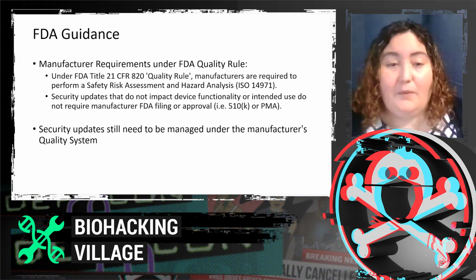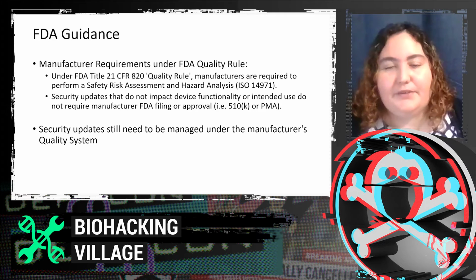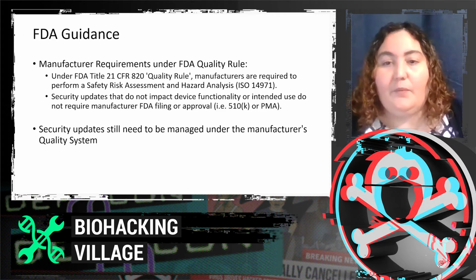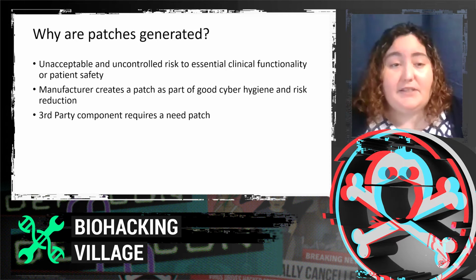Security updates are managed by the manufacturer's quality system, but they have made it easier to go ahead and push out to the customer. What is part of this process? There will be hazard analysis, formal testing, and then it'll be released. Why are patches generated?